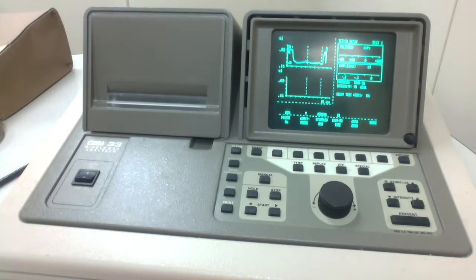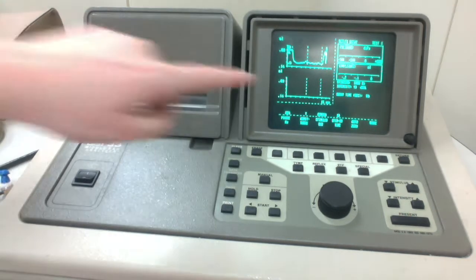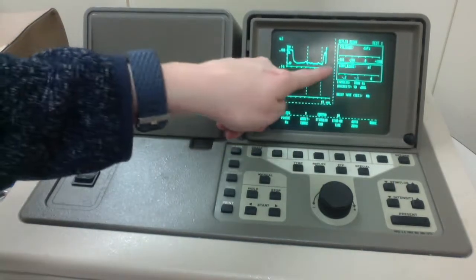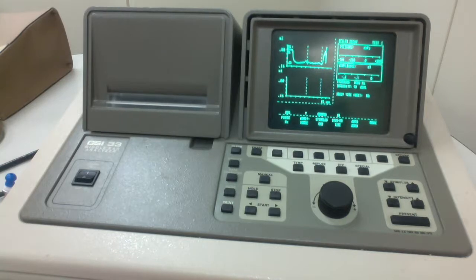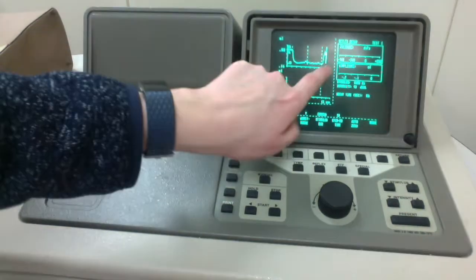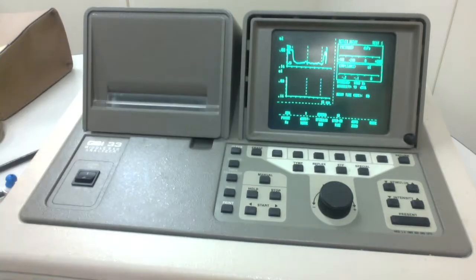Okay. So what happened was it played a 1000 hertz tone at 90 dB HL for 10 seconds, and it measured the contraction of my stapedius muscle. My stapedius muscle contracted and was able to stay contracted for the duration of the 10 seconds, which is what we want. That's what we call a negative decay. It means it's negative for possible retrocochlear.